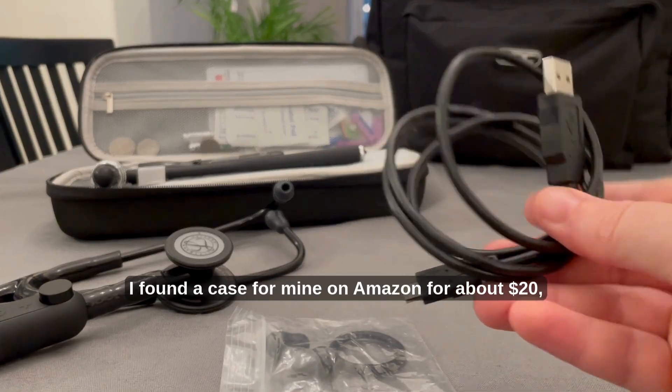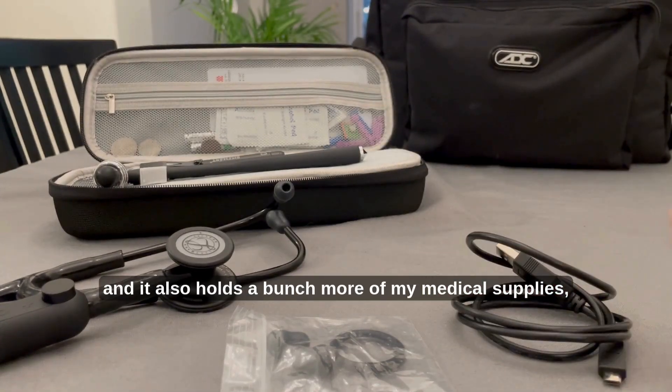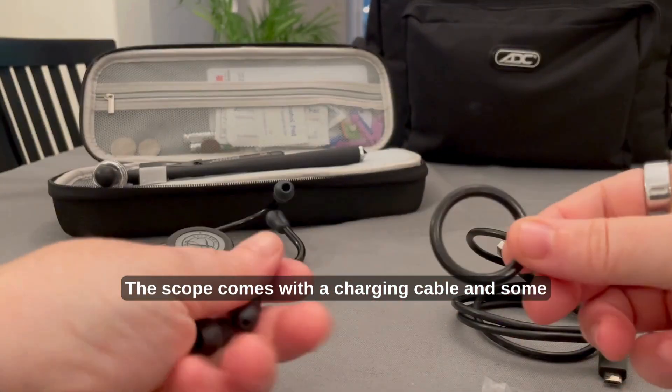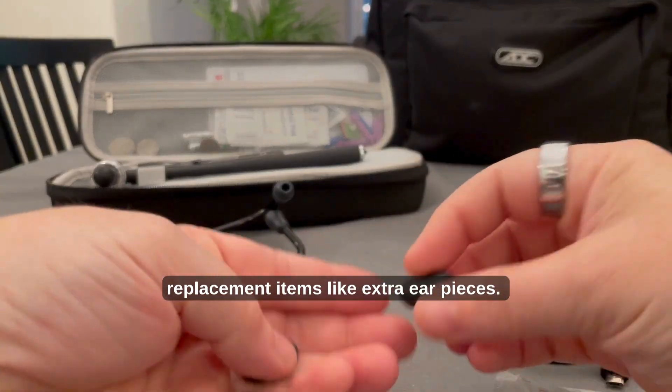I found a case for mine on Amazon for about $20, and it also holds a bunch more of my medical supplies — bonus. The scope comes with a charging cable and some replacement items like extra ear pieces.